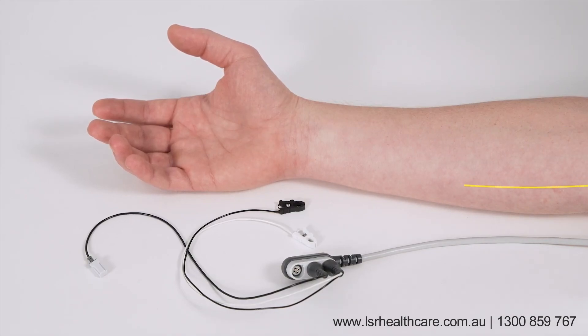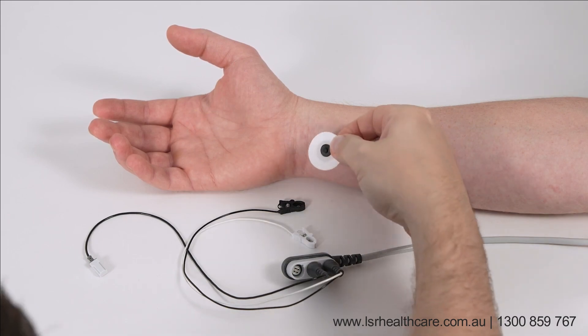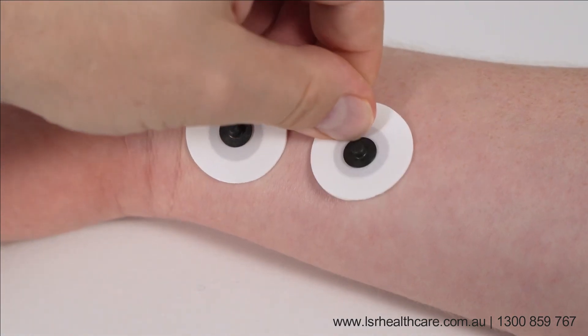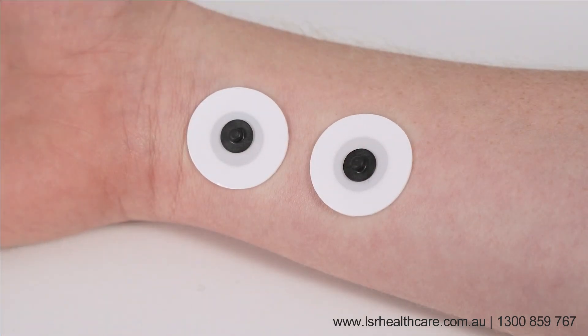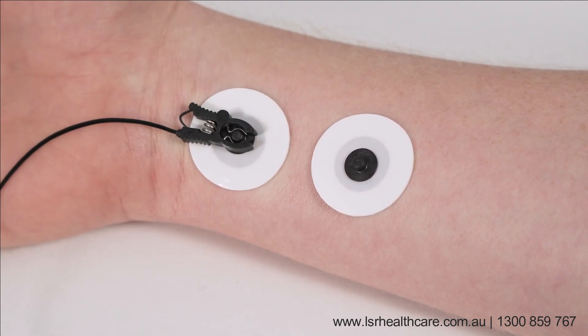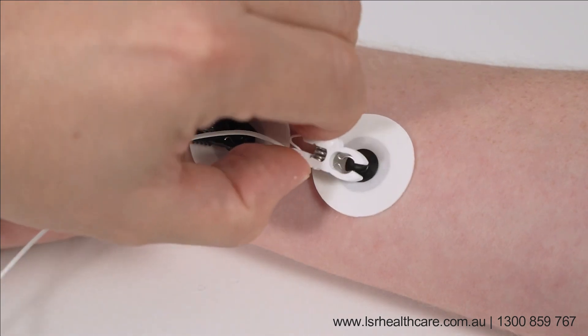Neuromuscular block is monitored by stimulation of nervus ulnaris and evaluation of the response at adductor pollicis. Place two electrodes over nervus ulnaris with approximately two to four centimeter distance. You may use any electrode, though it is recommended to use small electrodes. Fix the stimulation cables to the electrodes: black distal, white proximal.